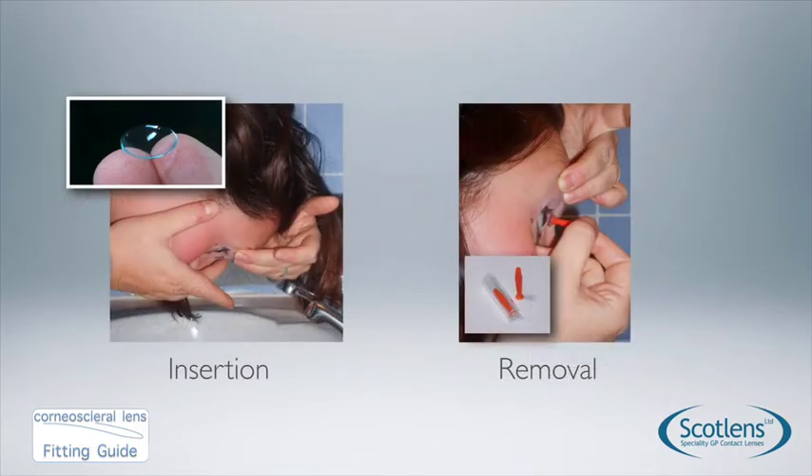There are insertion and removal videos on our website. To insert the lens, fill it with multi-purpose solution and have the patient place it onto the eye with the patient looking down. Removal is usually done with a contact lens sucker but can also be done with a lid pinch technique.